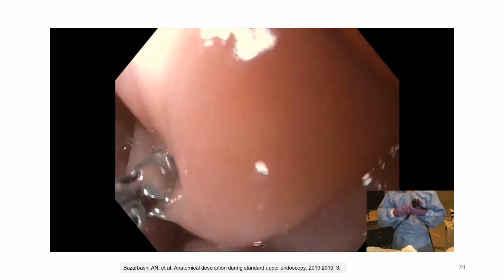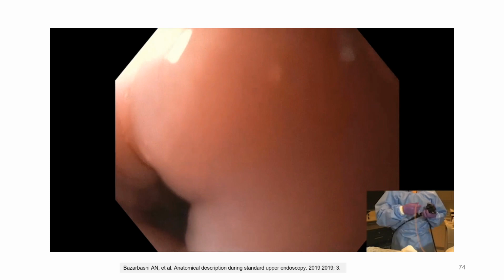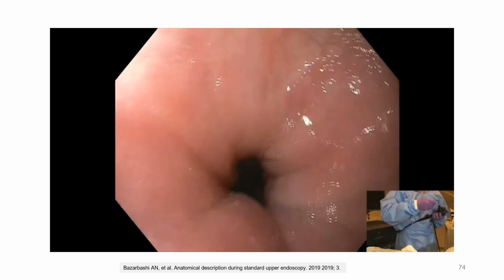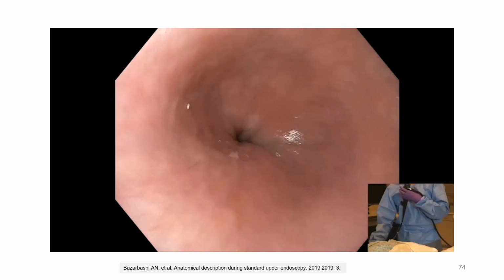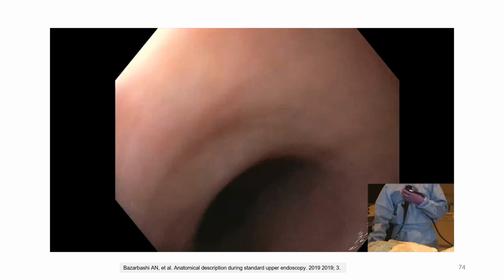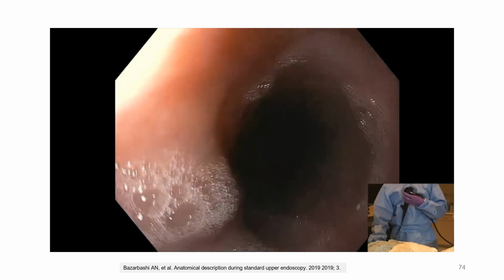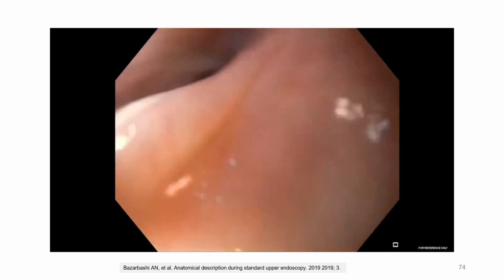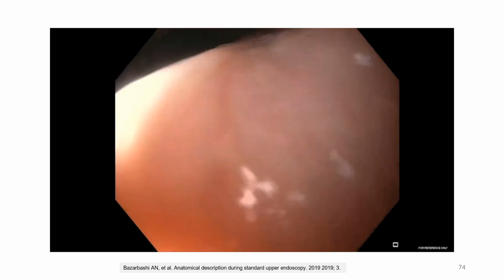The tubular esophagus may be difficult to biopsy because the forceps may cut off the channel parallel to the wall of the esophagus. This problem can be solved by the turn-in technique, in which the tip of the endoscope is turned to be more perpendicular to the wall of the esophagus through use of torque of either the right or left hand, and may be augmented by suctioning of the mucosa into the biopsy forceps.